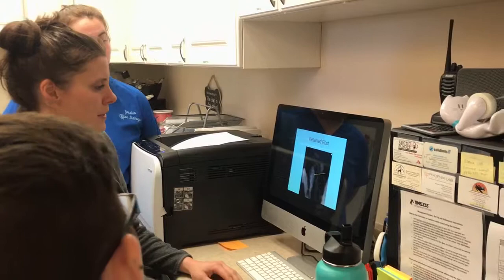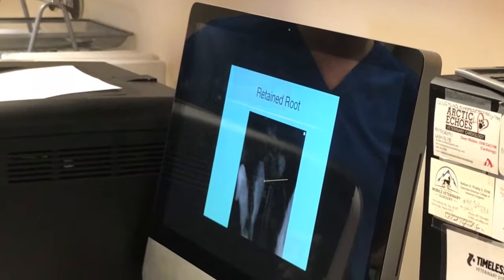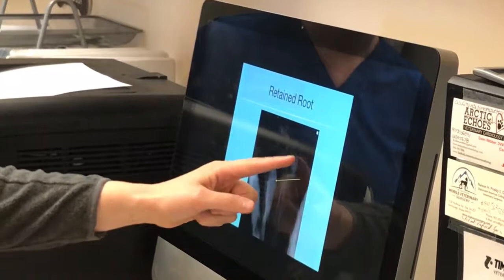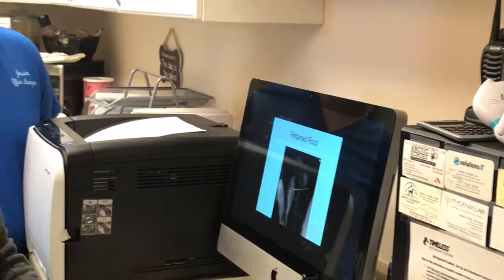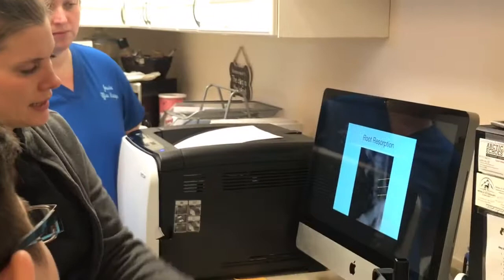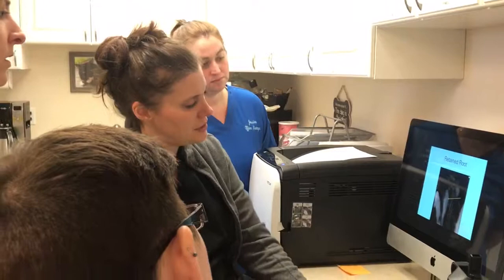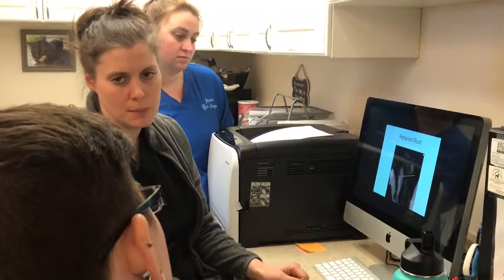Do these teeth just have to be pulled? Yes, they have to be pulled. This was an animal where the tooth was not visible at all — the only way we would have seen it was on X-ray. On the outside you just saw regular gums; it wasn't even red. Whether a root always needs removal depends — if the roots are being resorbed, the body is getting rid of it naturally and we don't need to go in there. But if that periodontal ligament line is still there, it's not being resorbed, and it's a really important site for infection and pain, so then we have to remove it.